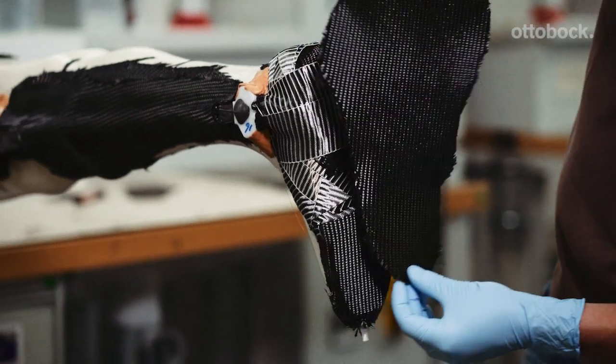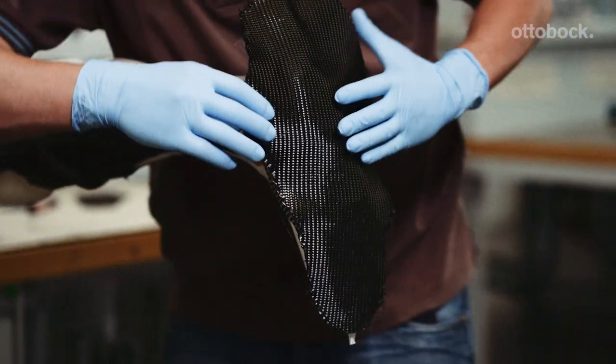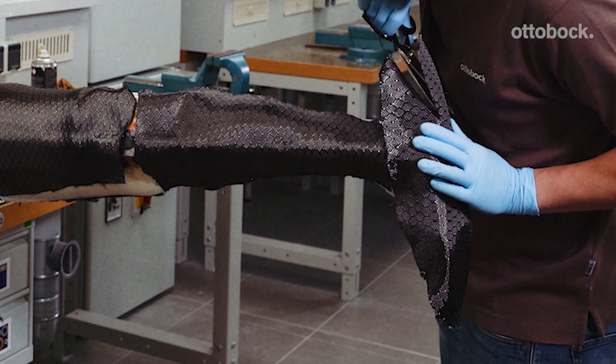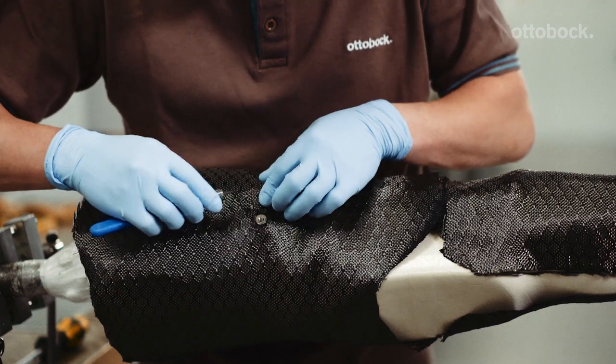No layers are required if the forefoot is to remain flexible. For the final layer on the foot, the entire foot component is covered with carbon fabric with a 45 degree fiber direction. Either Carbon Tex or cosmetic fabric can be used for the final layer on the thigh, lower leg and foot components.